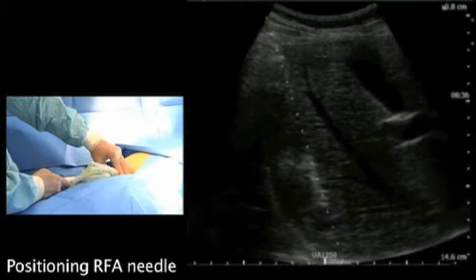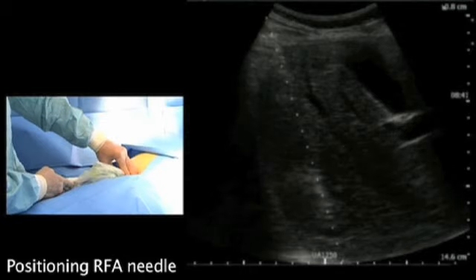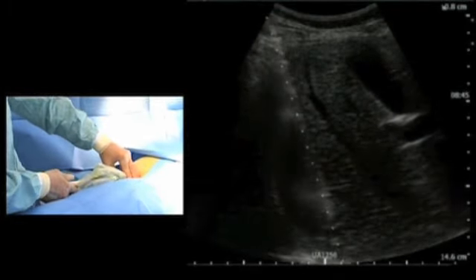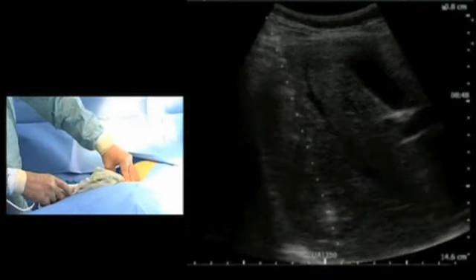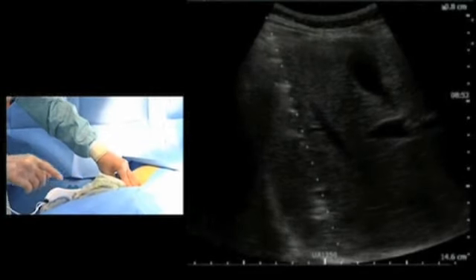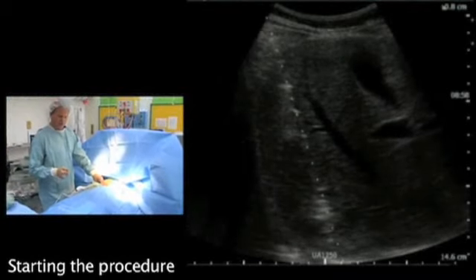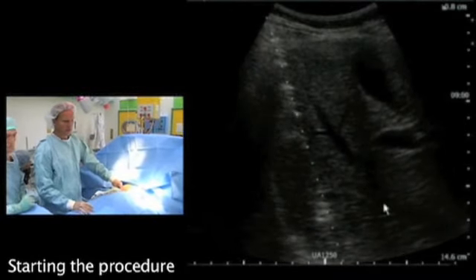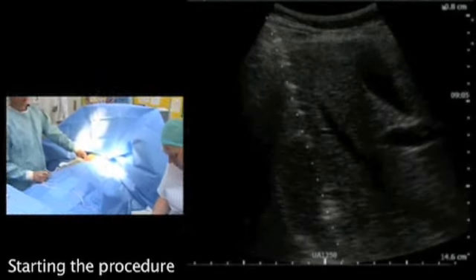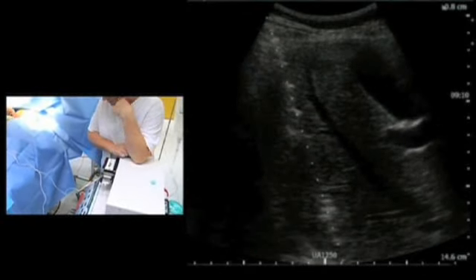Then we go to the center of the process, and then we take it a little bit backwards. Then we need to start. What we have seen is that we have opened the RF needle to 2 centimeters, and then I will ask our nurse to start the procedure on the blue button. Then the procedure is started, and we have started heating.